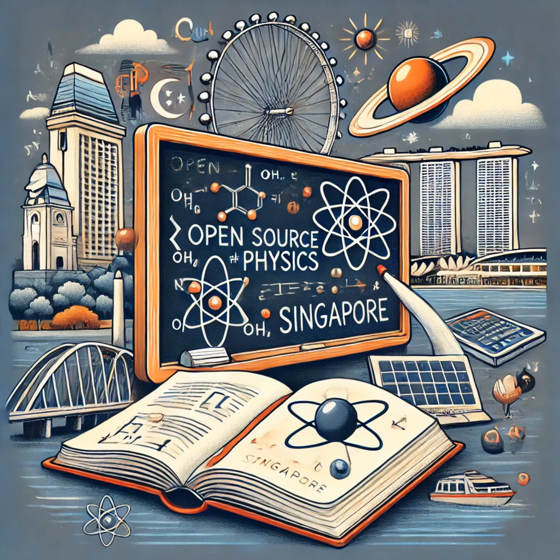So it's kind of like shining a light through different materials. Yeah, that's a great way to think about it. Some block more light than others, and that's what creates the patterns you see. And to get a really clear and useful X-ray image, there are a few key factors we have to control. Like what? Well, first, there's the quality of the X-ray beam, like how powerful it is, how much it can penetrate. Then there's the quantity of X-rays produced, how many there are. And we also have to think about something called filtration. It's like fine-tuning the beam to remove some of the rays that could actually blur the image. So it's not just point and shoot. Nope, it's way more nuanced than that. There's a lot of fine-tuning that goes into getting a really good result.